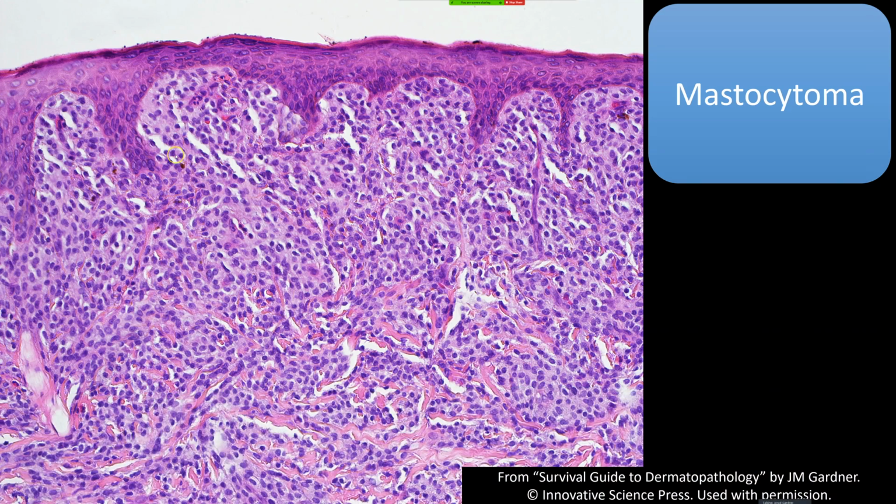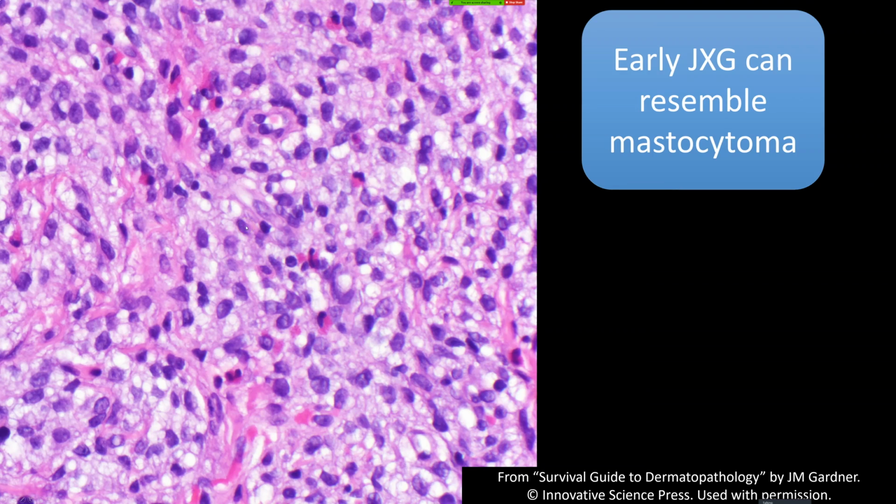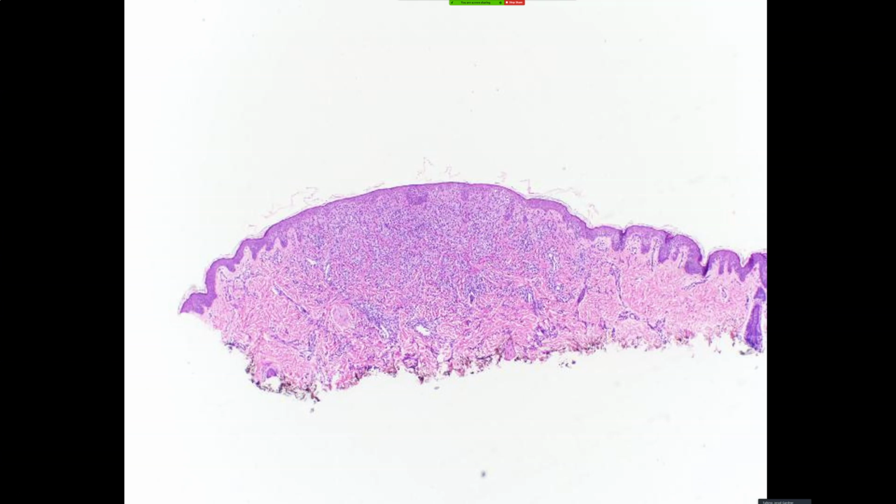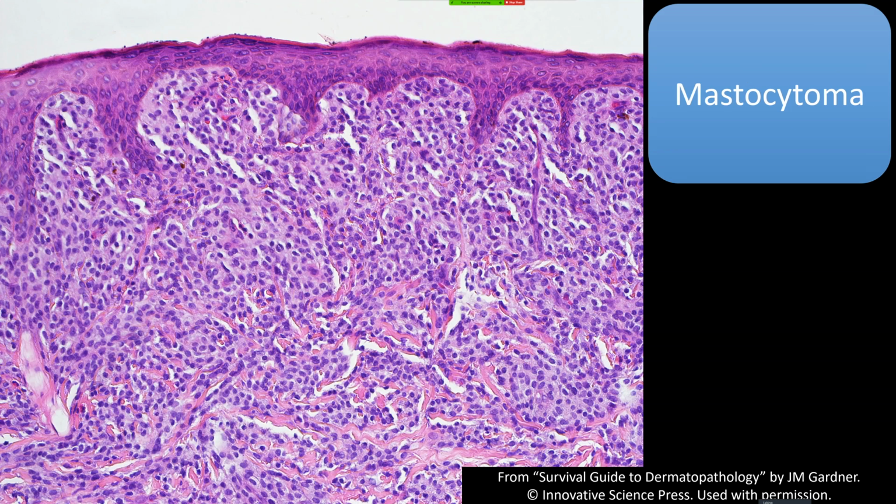So in any case, though, you can even see a couple little EOs in there, okay? But look, there is a little difference, but they look kind of similar. Somehow this one is a little bit pixelated, but okay.